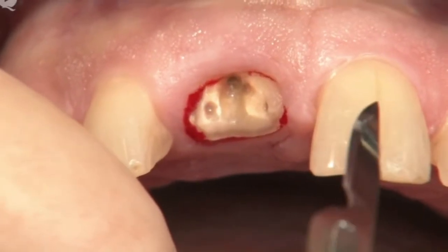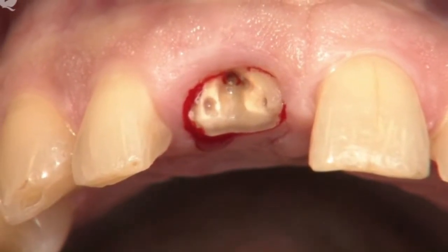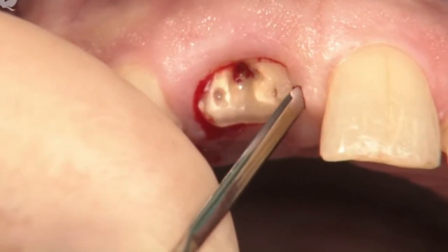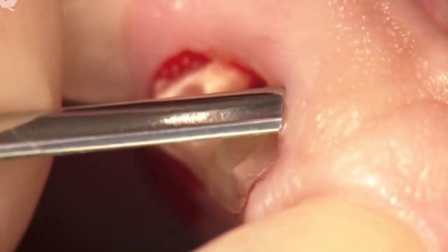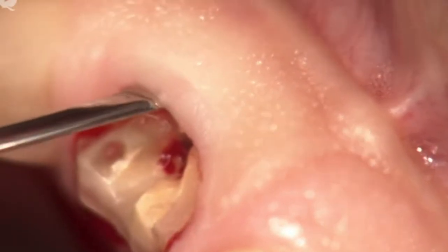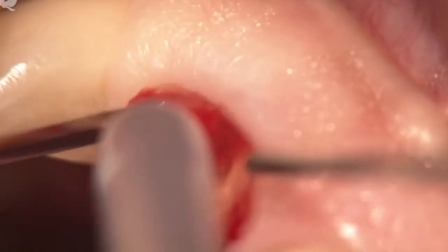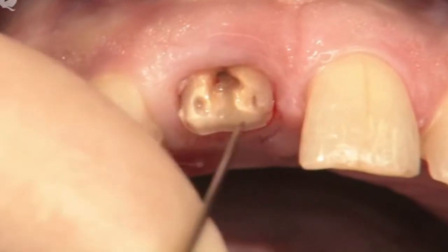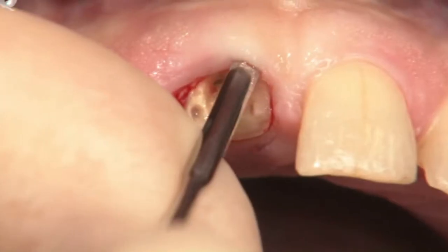Now if the tooth looked just like its counterpart in the second quadrant I would continue using the scalpel. But in this case I prefer a straight periotome so we don't perforate the facial gingiva. I'm using the periotome to sever the periodontal fibers. You can see how my hand is supported so the instrument doesn't slip off.